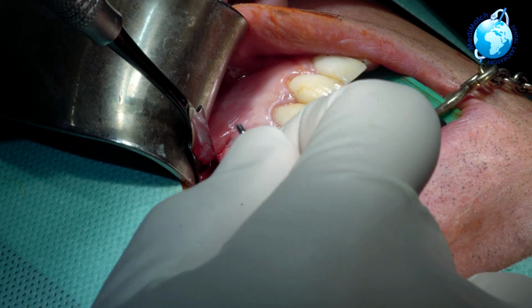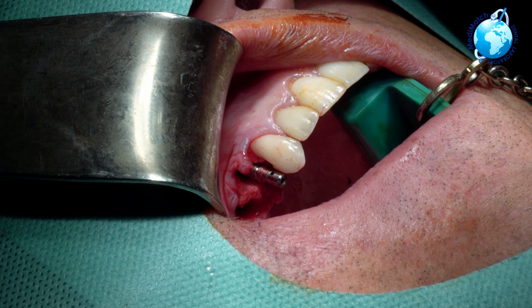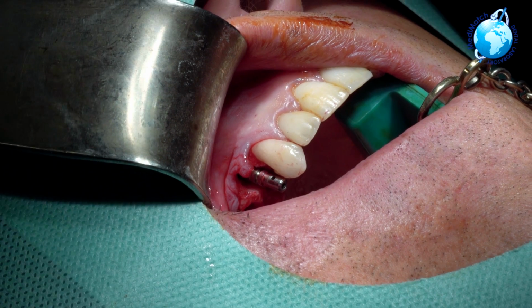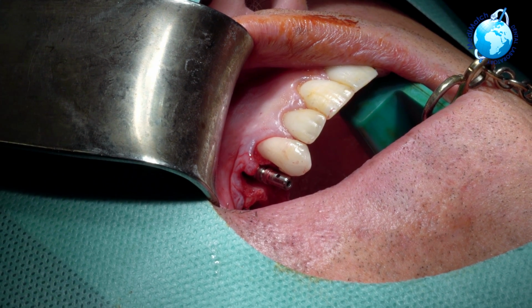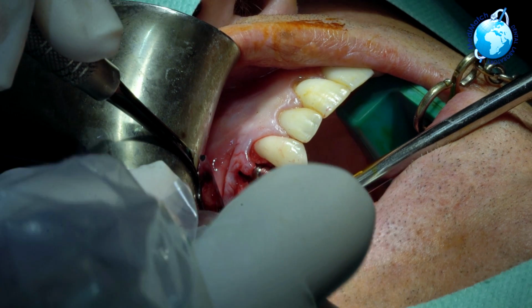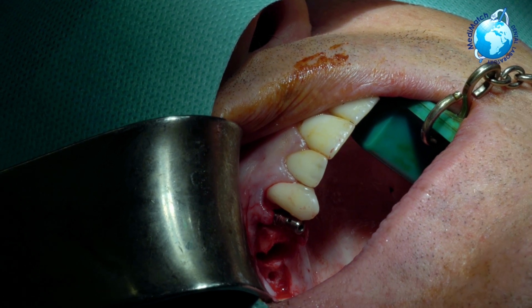Okay. I'm quite happy I'm away from the root of the canine and I'm going for the sinus lift at the back now. Really simple. Give me the measurement. Go onto that space distal of the bigger defect. Tell me what implant we have. We've got 4.5 by 10. Okay, so you've gone onto that space. Measure that bone. What we've got is 5 mil, 7 mil stop with the gingival stop here. I want to parallel up to this particular implant here. Correction, what was the implant again? 4.5 by 10. Okay.